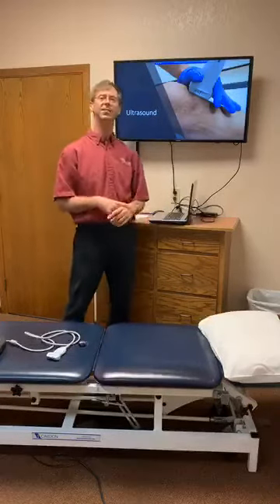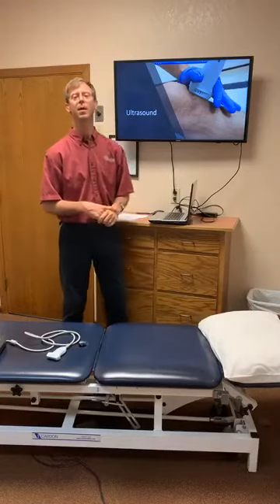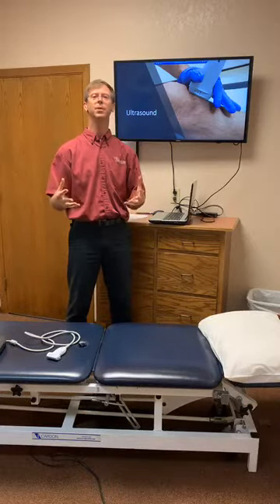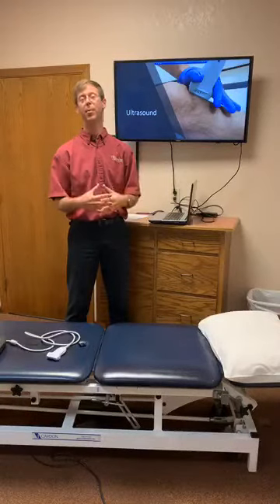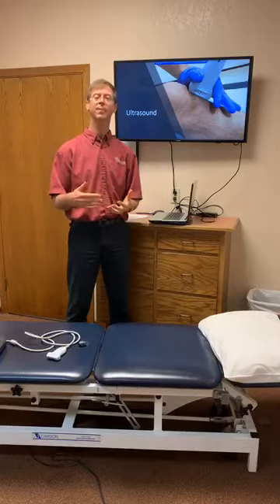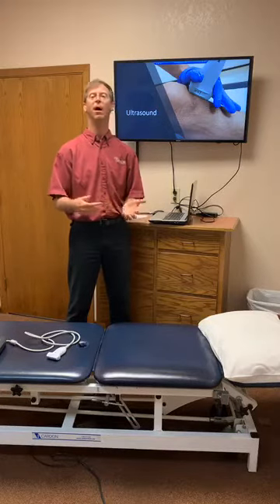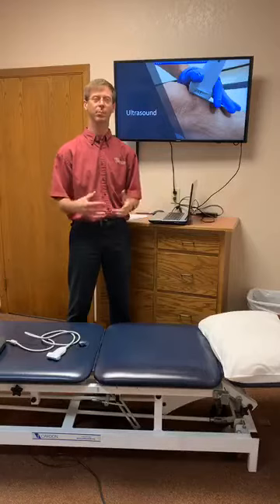Ultrasound, two different kinds of ultrasound. There is therapeutic ultrasound, we'll talk about that first. And then there's diagnostic ultrasound. Therapeutic ultrasound uses sound waves to help facilitate healing. The body absorbs the sound waves. It penetrates through soft tissues such as muscles, tendons, ligaments, bursa, fat, connective tissues, and it would bounce off bone, hard surfaces, like the bone primarily.